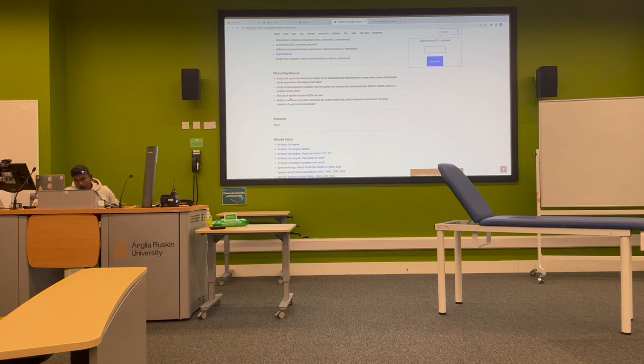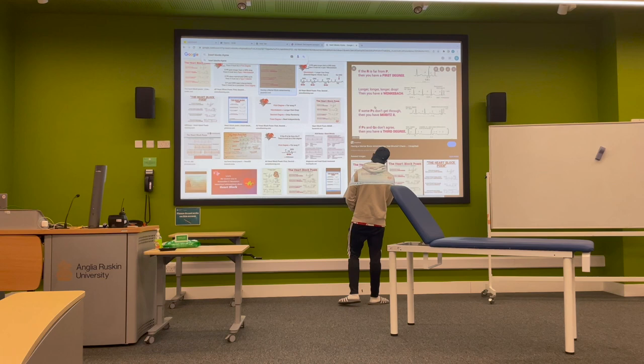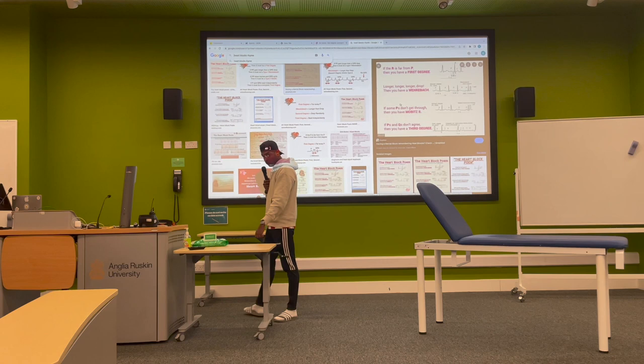Then, finally, I'm going to go on to third degree, which is a complete heart block. And that's that: P's and Q's don't agree. So you can see, look, the P to the Q is that distance. And the P, there's one among this, and there's that distance. Then the P's here, there's no Q, and then there's a P, and there's a Q there. It's all over the shop. There's no real rhythm, there's no real pattern, there's no real following one can do of this electrocardiogram.